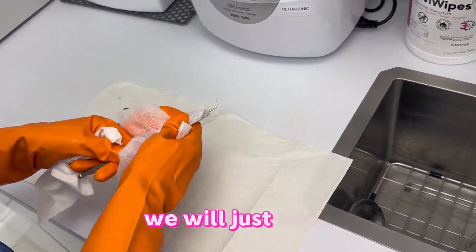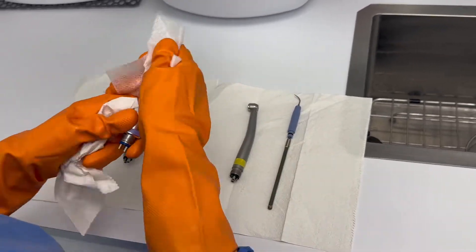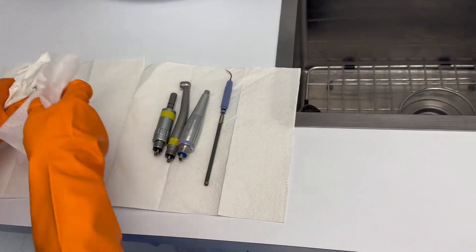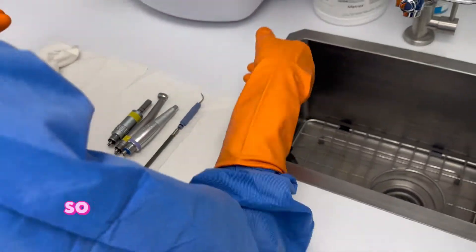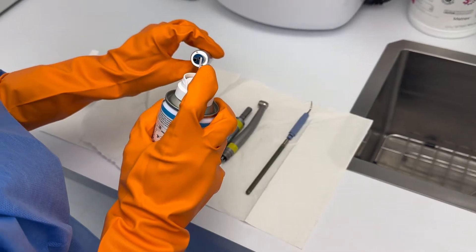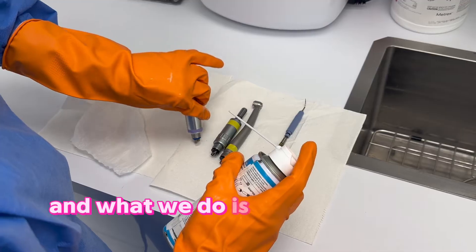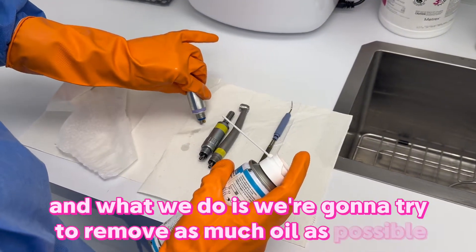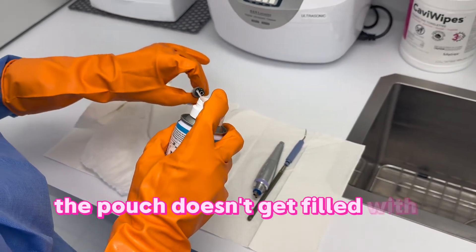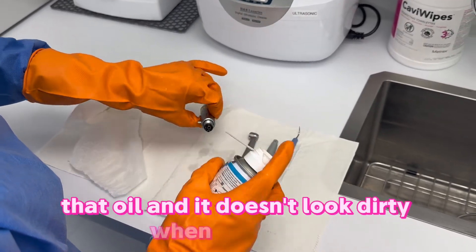We will wipe the handpieces down and we need to oil them, so we're going to get the lubricant to oil them. We want to try to remove as much oil as possible so that when we're putting the handpiece in the pouch, the pouch doesn't get filled with oil and look dirty when it's sterile.